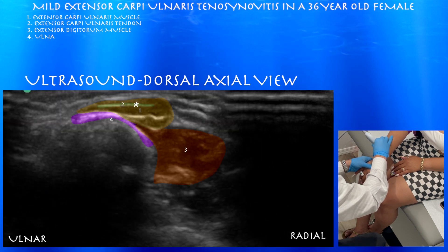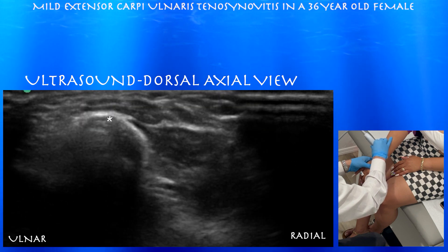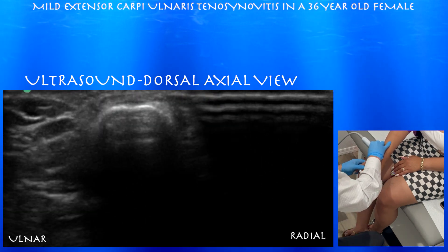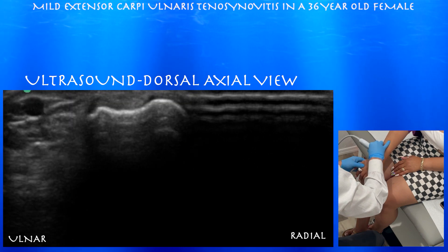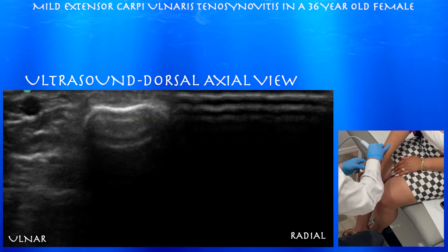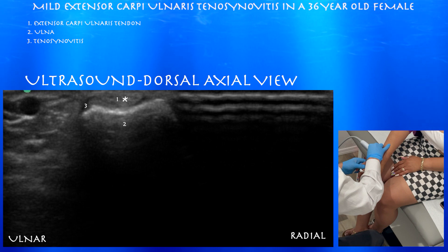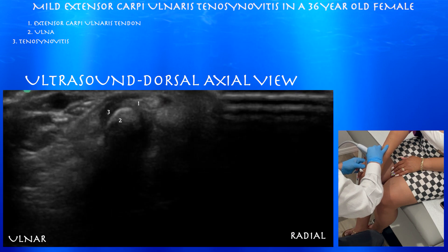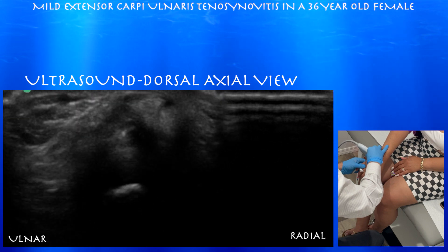Here's the extensor carpi ulnaris tendon beginning to form — it looks like just a thin sliver within the muscle just above the ulna. Now we can see the tendon starting to form above the ulna. There's a little concavity within the surface of the ulna where you see the extensor carpi ulnaris tendon. You can appreciate a tiny sliver of fluid around the extensor carpi ulnaris. There can typically be a cleft within the extensor carpi ulnaris tendon, which is essentially a normal variant. Here you can appreciate a moderate amount of tenosynovitis around the extensor carpi ulnaris tendon, and you can also appreciate that cleft within the tendon as well.